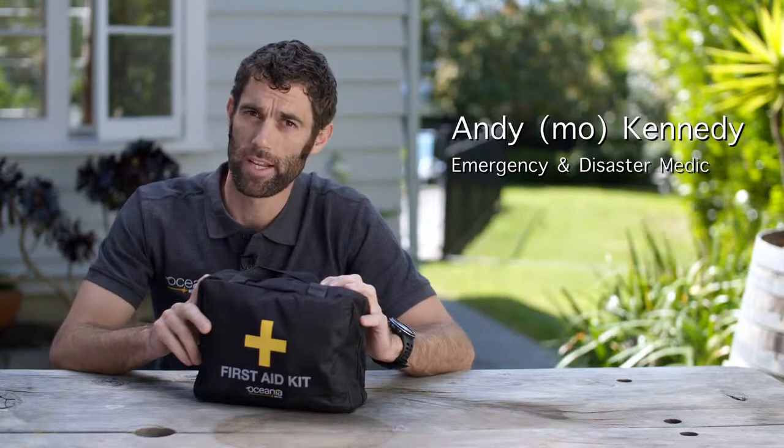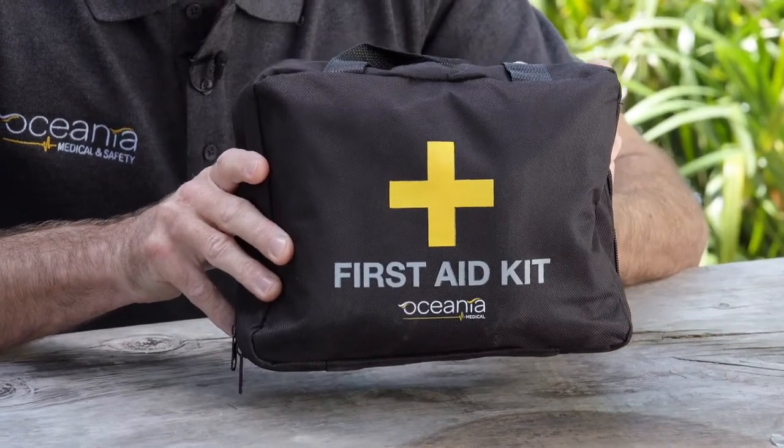My name's Andy. I'm a paramedic with over 10 years of military trauma experience. This here is a forestry or remote site trauma kit.